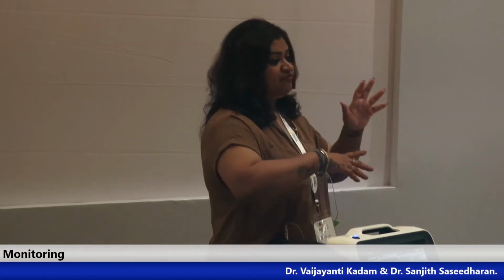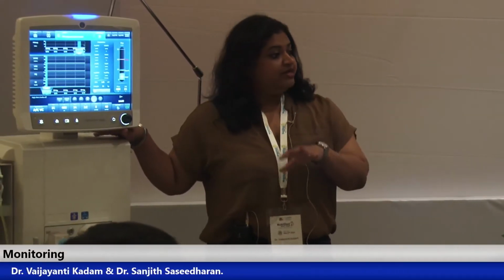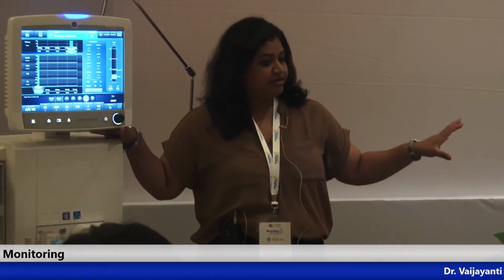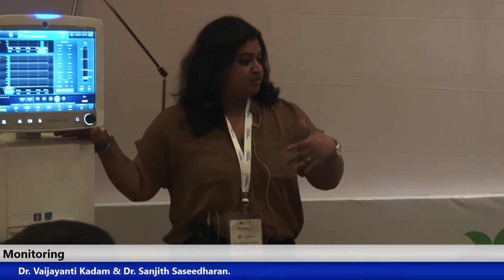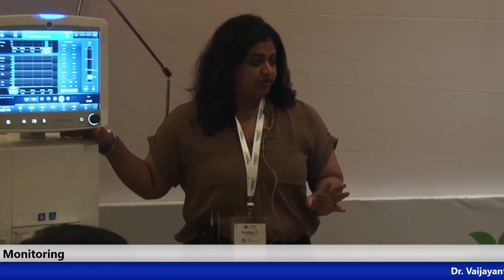If a patient whose requirements are very high is underfed, what is going to happen? They are probably going to be prolonged ventilated, isn't it? So that answers everything. That is the reason why indirect calorimetry is widely used in many countries. We have just started using it in India. Our institute uses it the maximum in Mumbai, I would say in India also, in fact.